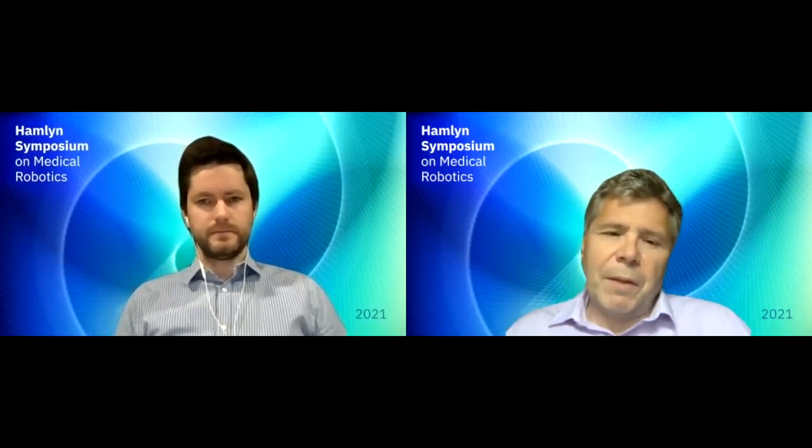To help make the surgery more delicate, you can move in very small areas, and we had a scaling factor, and we turned the scaling down. So they had to move maybe 10 centimeters to be able to move 10 millimeters. After a while, they said this was too slow, and they wanted this moved up. So there are various different things that we'd actually do, and different surgeons might want different scaling. But yeah, that's the type of system we have.